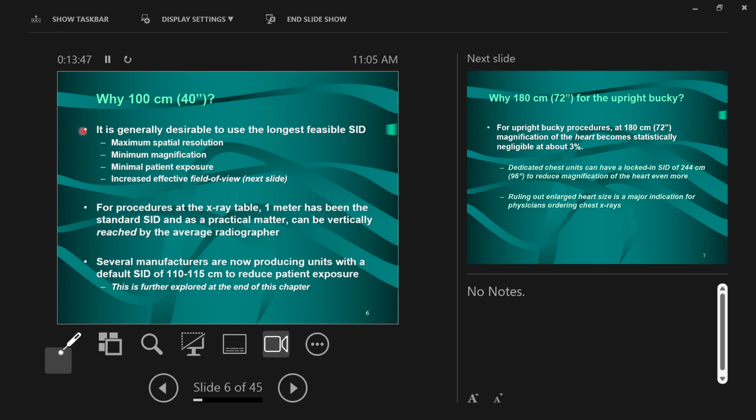So here's, go ahead, no, please. I know there's a term, I don't know the term exactly, but it's the maximum amount of visibility, I guess, in the x-ray determines that size, right? Yeah, well, the way to think about it is the further your source, the longer your SID is, the better your spatial resolution will be. Okay, it will always be better the further away it is.